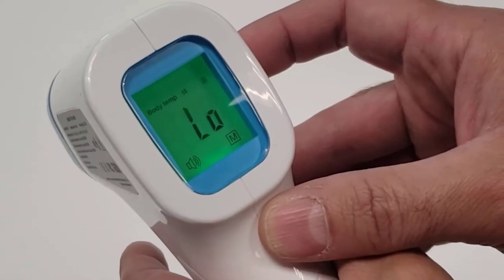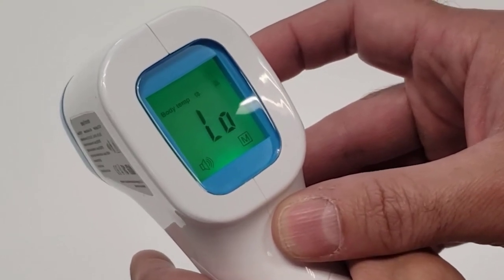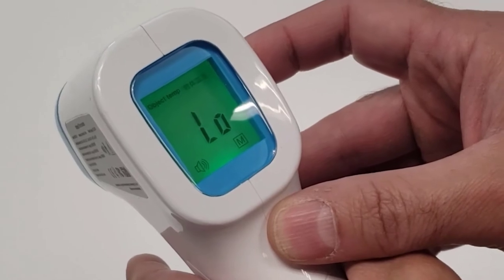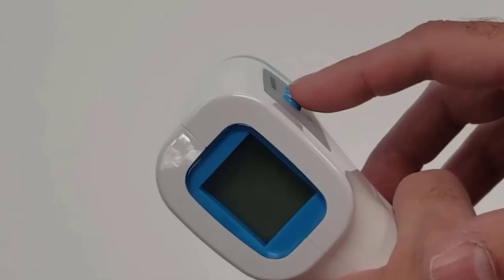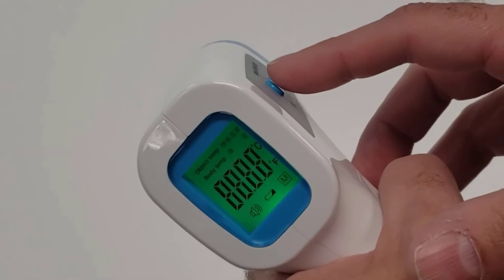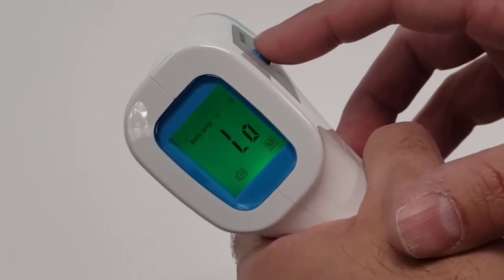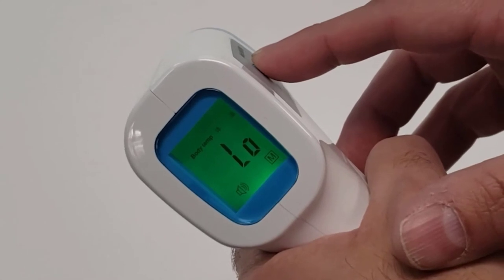Next is setting up the thermometer based on preference. To switch between body temperature or object temperature, press the set button on the side of the unit. Once you have chosen a preference, you can then choose Celsius or Fahrenheit for your temperature reading. To do so, press and hold the set button for 3 seconds.